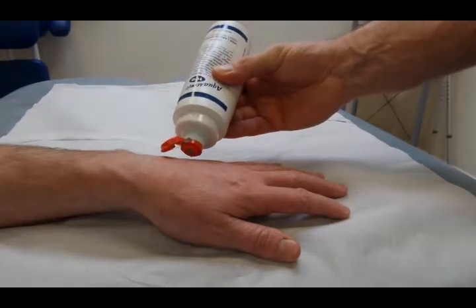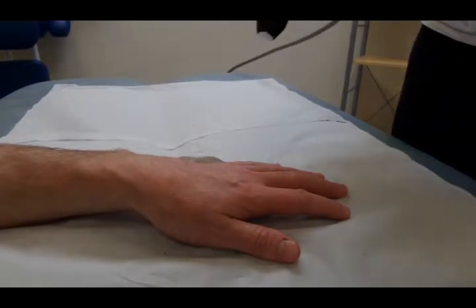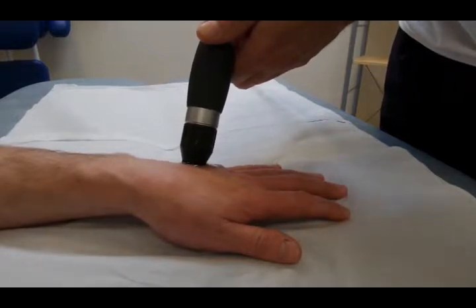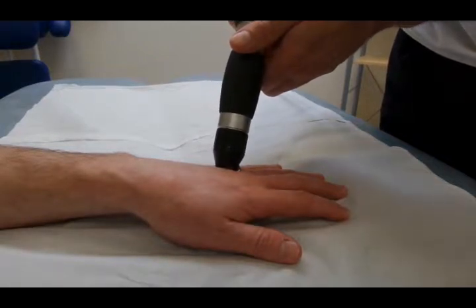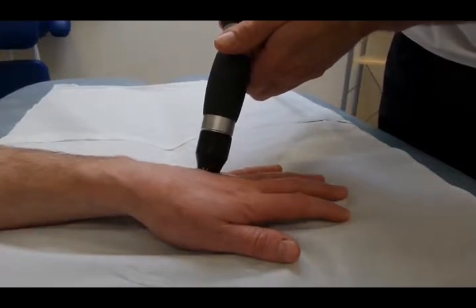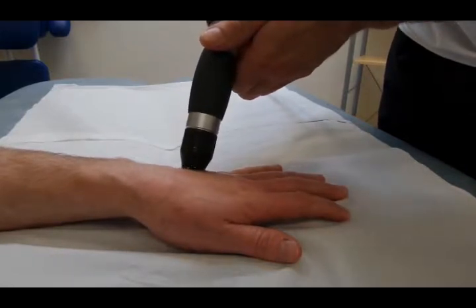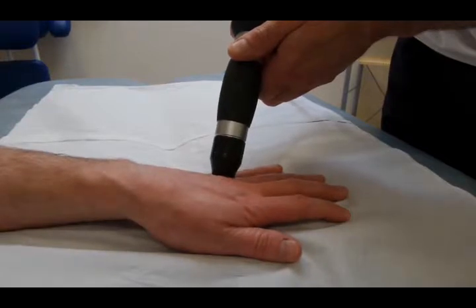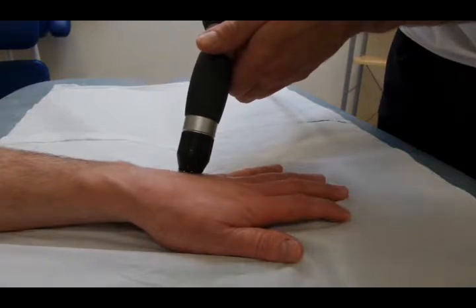We're back with the hand here. Treatment between the 4th and 5th metacarpals. We put some gel on, spread the gel out and start with treatment to the hand. The central part of the gutter between the 2 metacarpals seems to have cleared and there are 2 focal areas now of discomfort — one down at the proximal phalangeal joint and one up at the metacarpal joint.